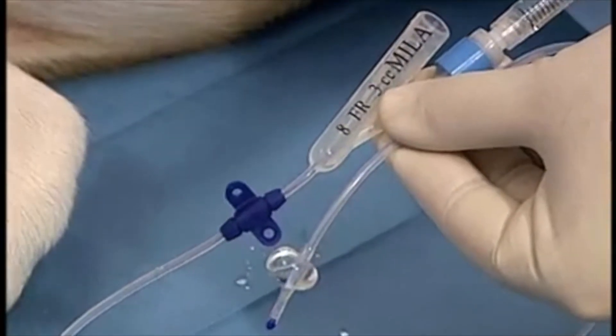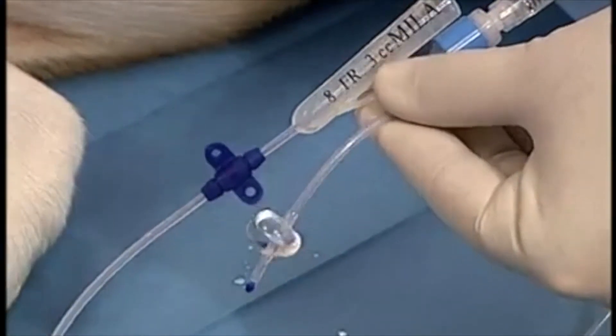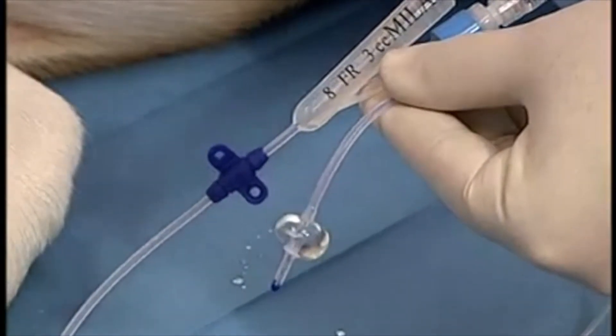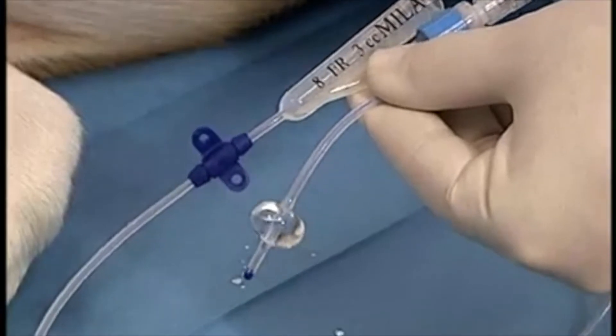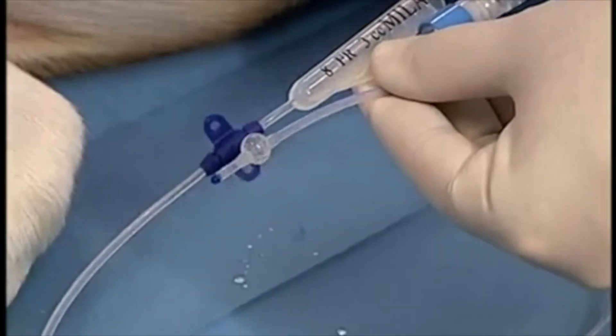There is a 3cc balloon at the end of the catheter. This should be checked for patency by infusing 3cc of saline into the balloon. Once the balloon has been checked, the saline should be removed prior to insertion of the catheter.